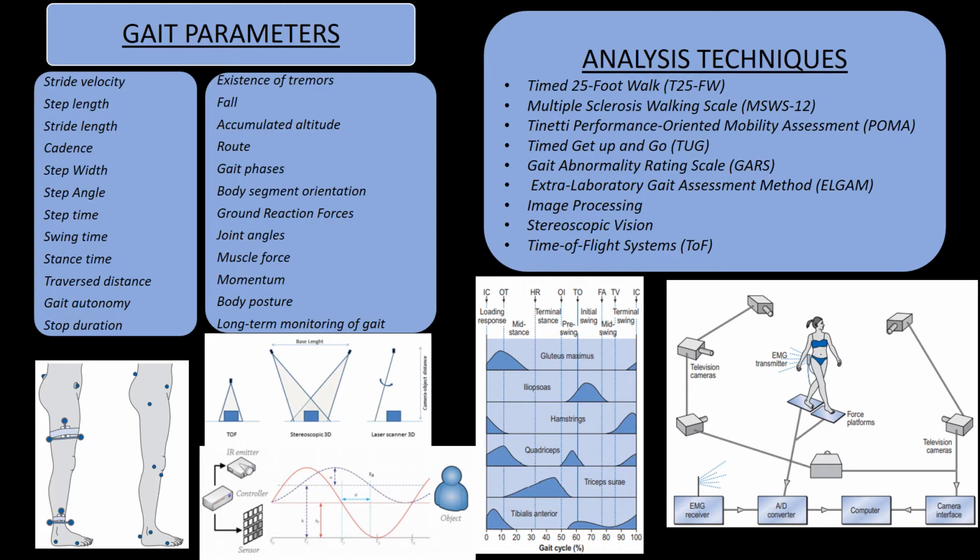A typical image processing system is formed by several digital and analog cameras with lenses that can be used to gather gait-related information. Techniques such as threshold filtering, which converts images to black and white, pixel count to calculate the number of light or dark pixels, or background segmentation, which simply removes the background of the image, are just some of the possible ways to gather data to measure gait variables.